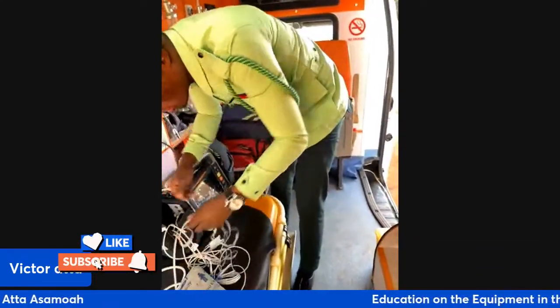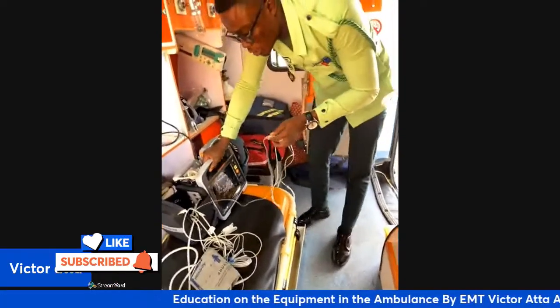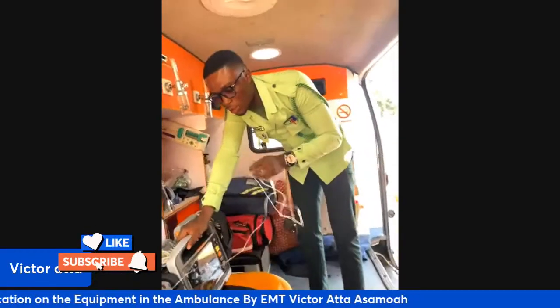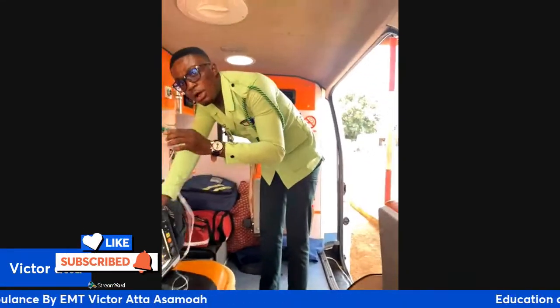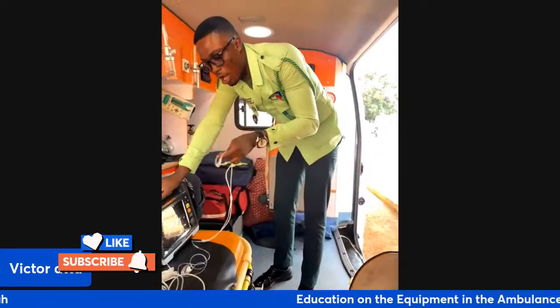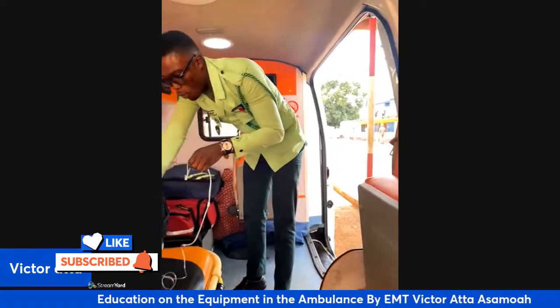Basically, the CO2 is often used on unconscious patients. So when you are transporting an unconscious patient and you want to know whether the patient's condition has deteriorated or is being stabilized, the CO2 will allow you to know whether your patient is alive or not alive.